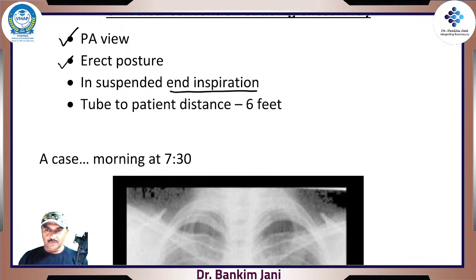Suspended inspiration means hold. So you'll tell the patient, take a breath, and when the patient is breathing, we say stop, right? And as the patient stops, we watch whether his shoulders are moving, right? If he is moving, you say no again. Otherwise, your image would be blurred. So, deep inspiration, hold, you watch that his shoulders are steady, then you take the X-ray, and in a split second, the X-ray is taken.